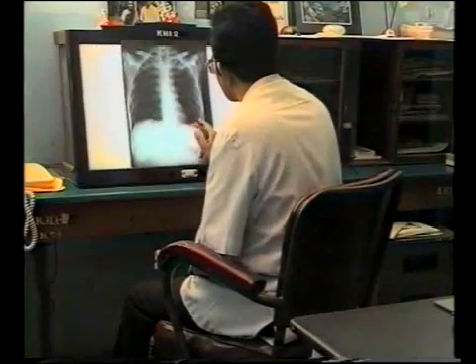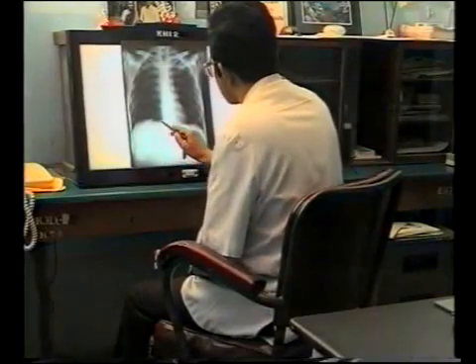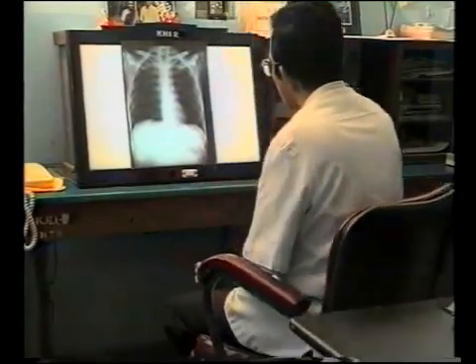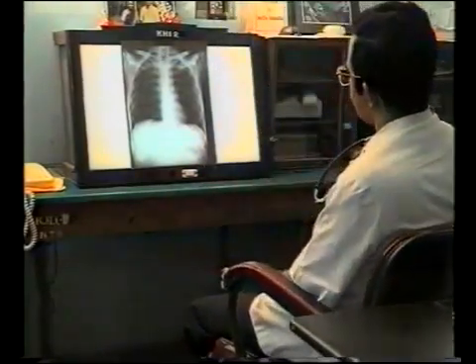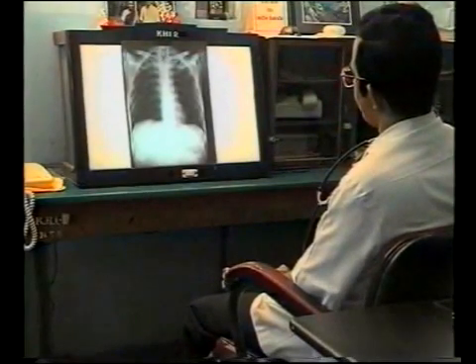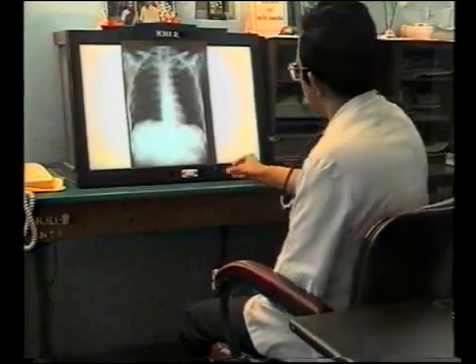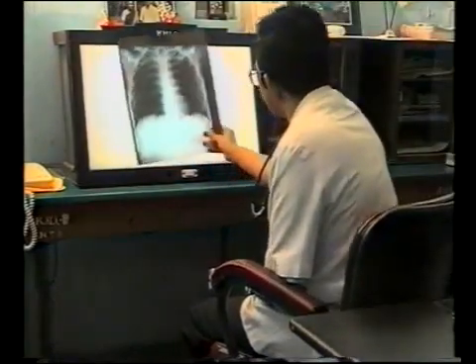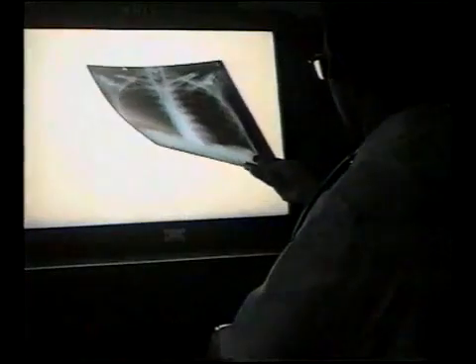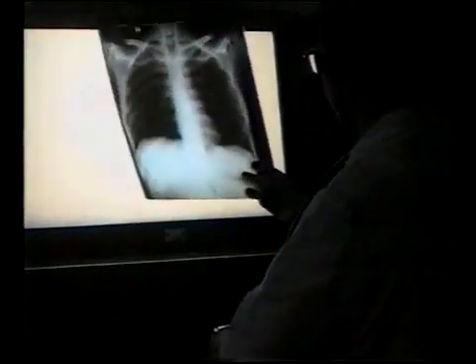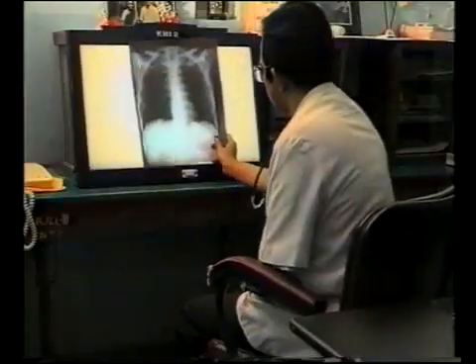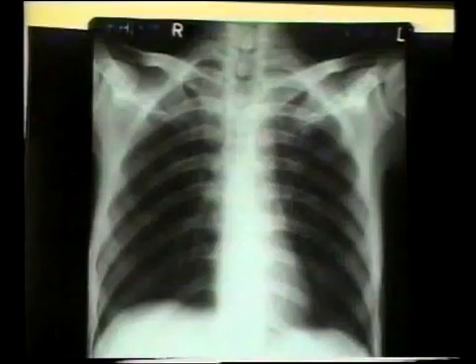After studying all these minute details, it is very important to stand at a distance and look at the film as a whole, because many times a close and minute inspection may miss a gross change. Then hold the film at an angle and view it slightly tangentially. Minor changes in radiolucency of the lungs are better appreciated this way. This completes the study of an X-ray of the chest.